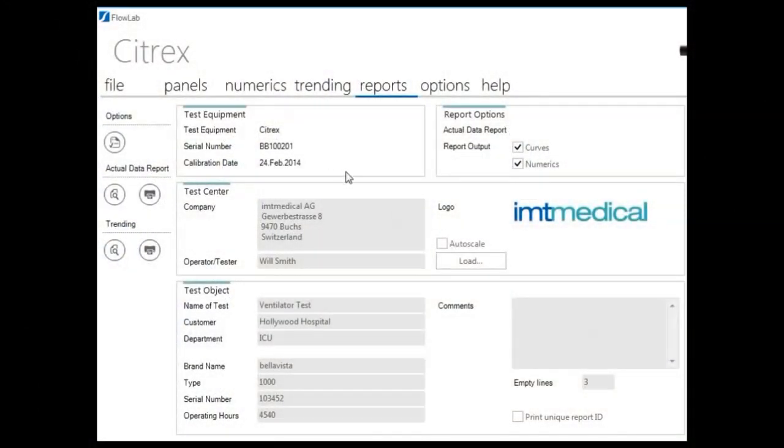Customize test reports in FlowLab. Enter your company name, address, and logo.